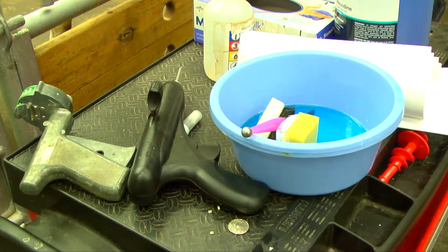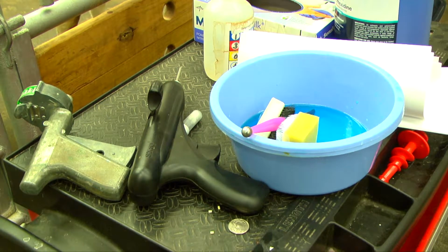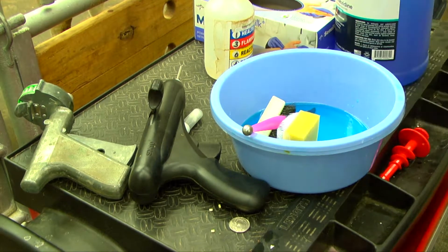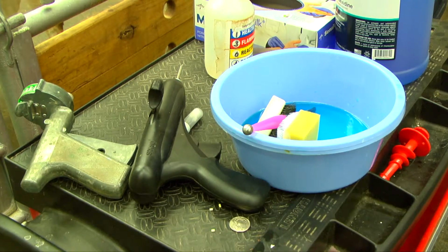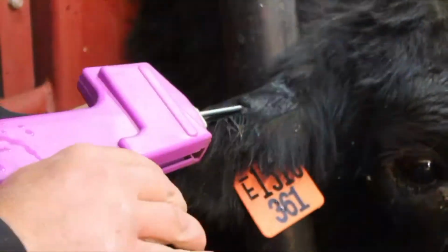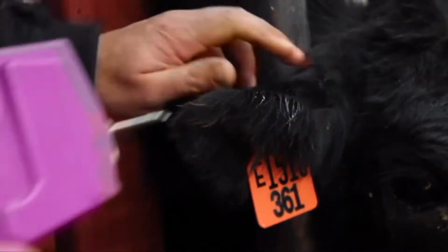We picked out where we're going. I do want to bring up we have two different styles of implant guns. The first implant gun has a retractable needle. I like to think about that needle as a tunnel. We administer that needle with the bevel up, at a slight angle, get it just under the skin on top of the cartilage of the ear, and place that needle all the way in. Once we do that, that's created our tunnel. With the retractable needle, we can pull the trigger, it automatically retracts, and leaves the implant right in place.